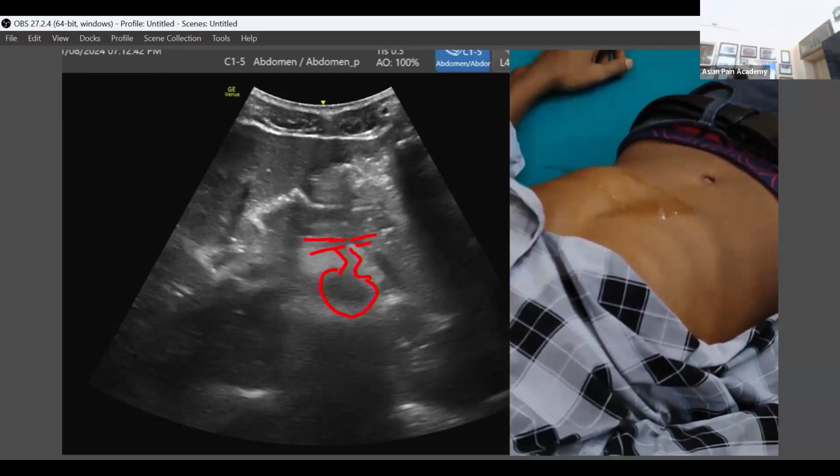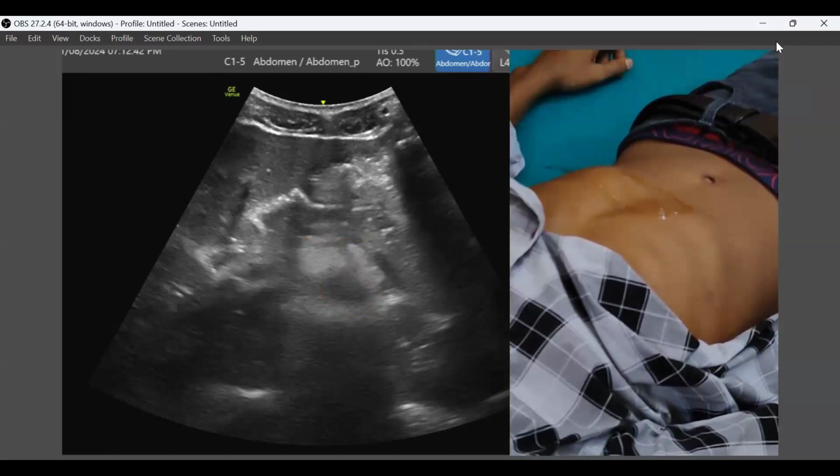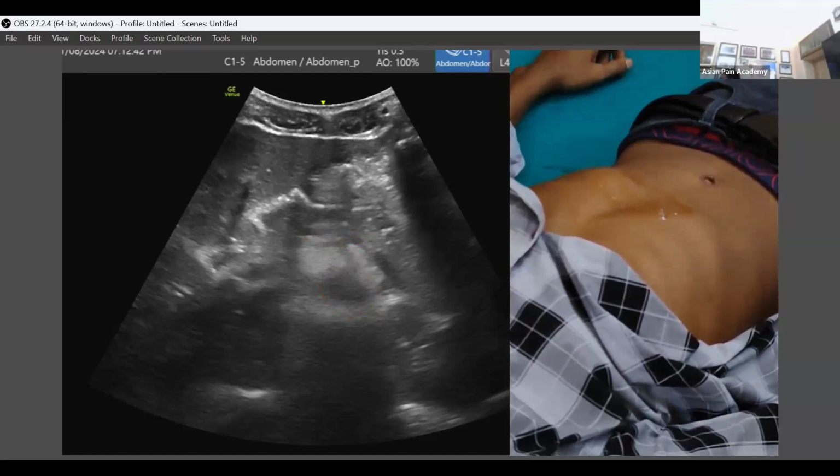So everyone can see this picture. So fortunately, I got a very good window. Everyone can see this picture. The division. Yes. So this is known as the Seagull sign. So usually we take it as a wing, and this is another wing. So this is the Seagull sign. So once we got the seagull sign, everything is easy. Just go at the top of the seagull.